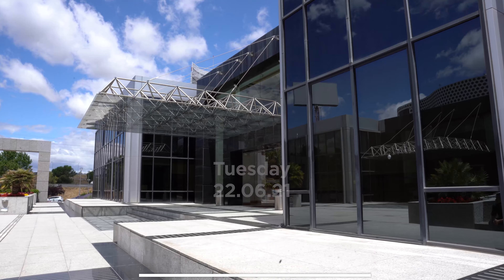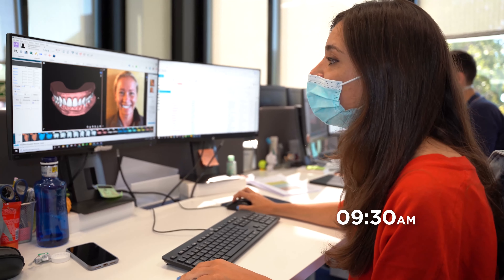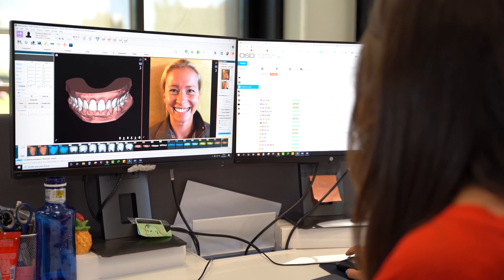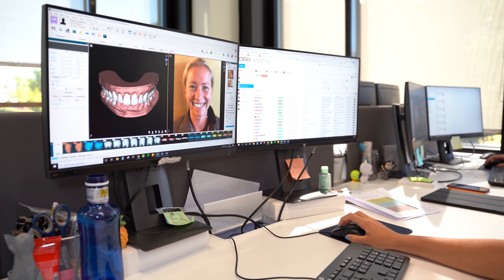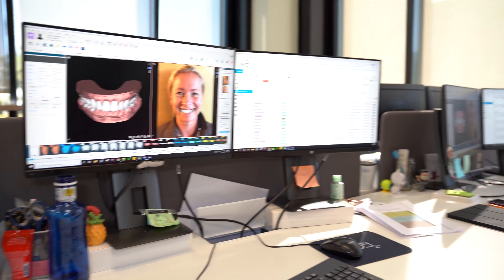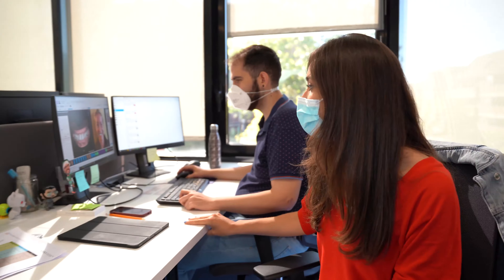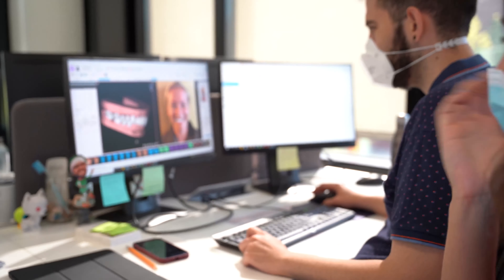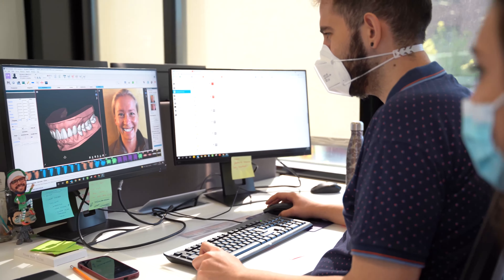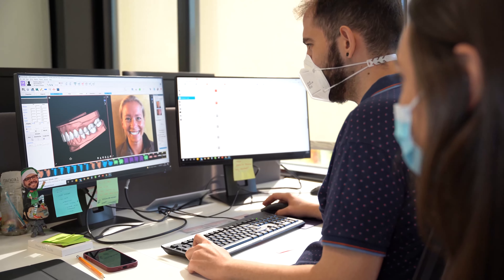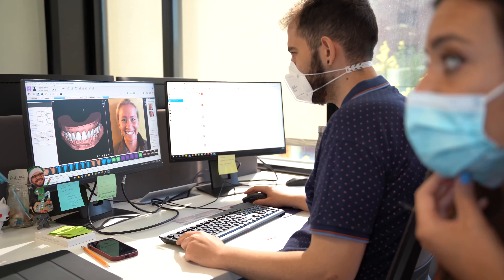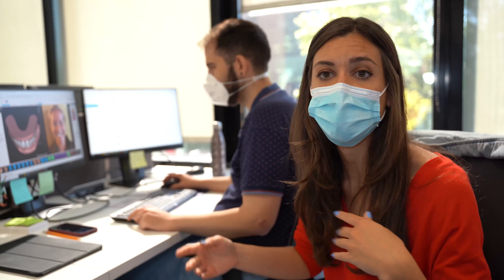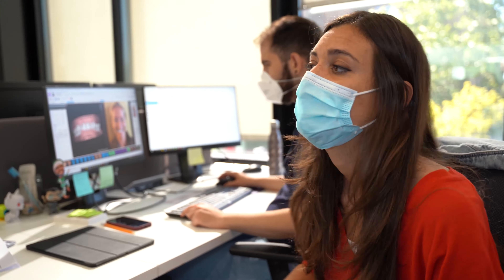We just finished the two options of the case. This is the final outcome of the first option, the orthognathic one. And Manu is giving the final touches of the second option — just ortho and crown lengthening procedure, as you can see. Now both options are ready to go to the next step, which is quality control, so I can talk with Tatiana to proceed with it.